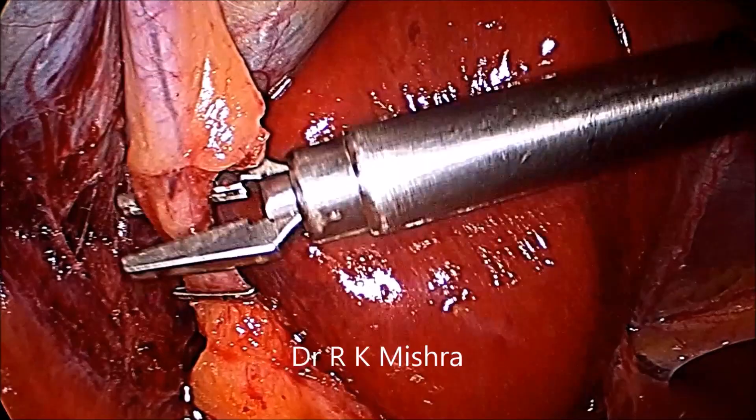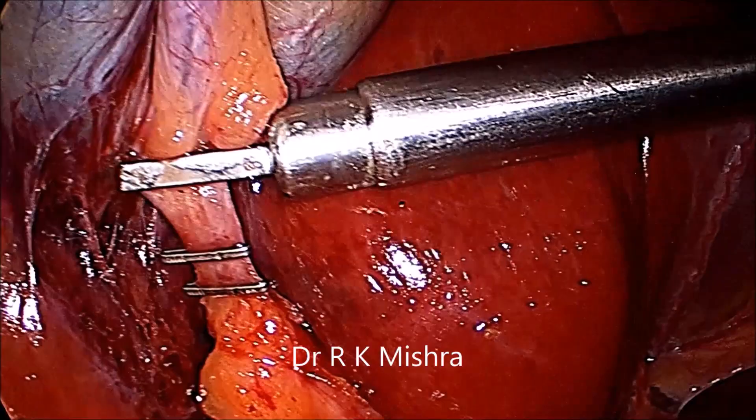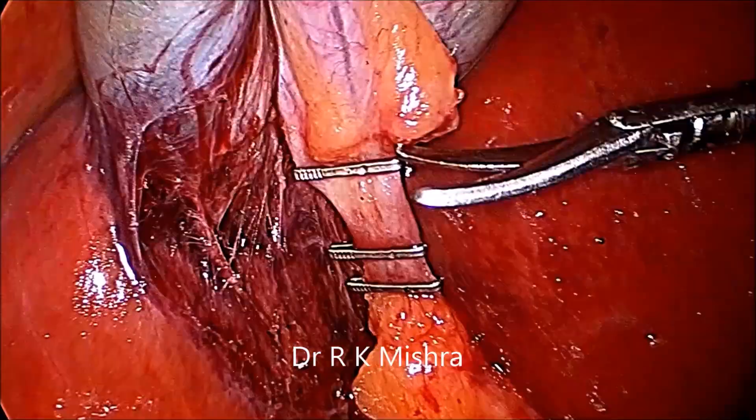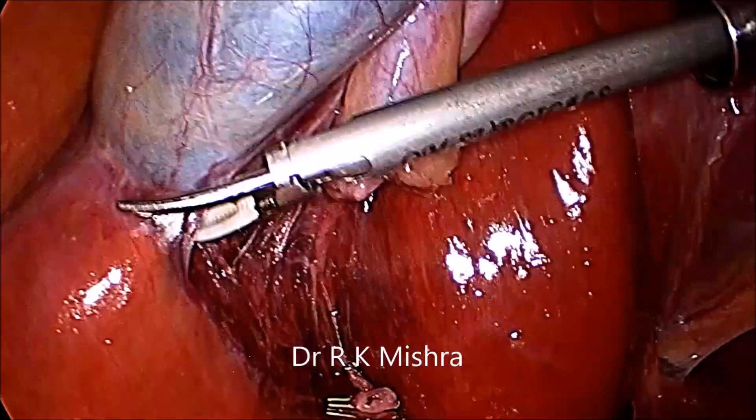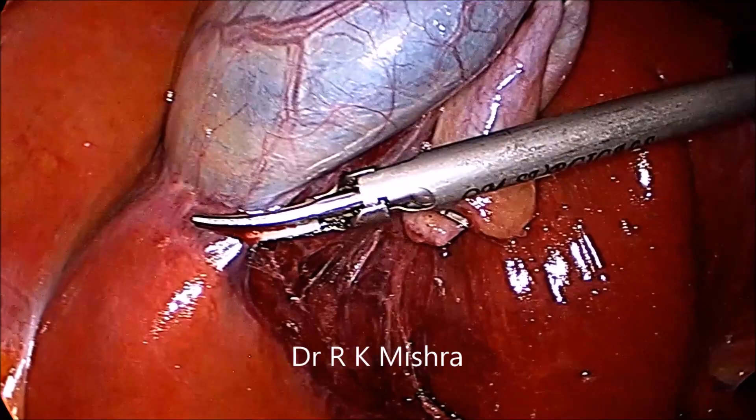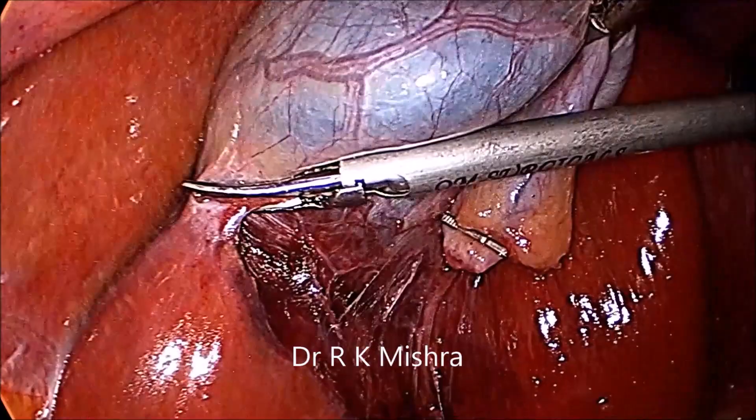The distance is three millimeters between the first and second clip, and six millimeters between the second and third. After that, you can cut the cystic duct and then separate the rest of the gallbladder from the liver.